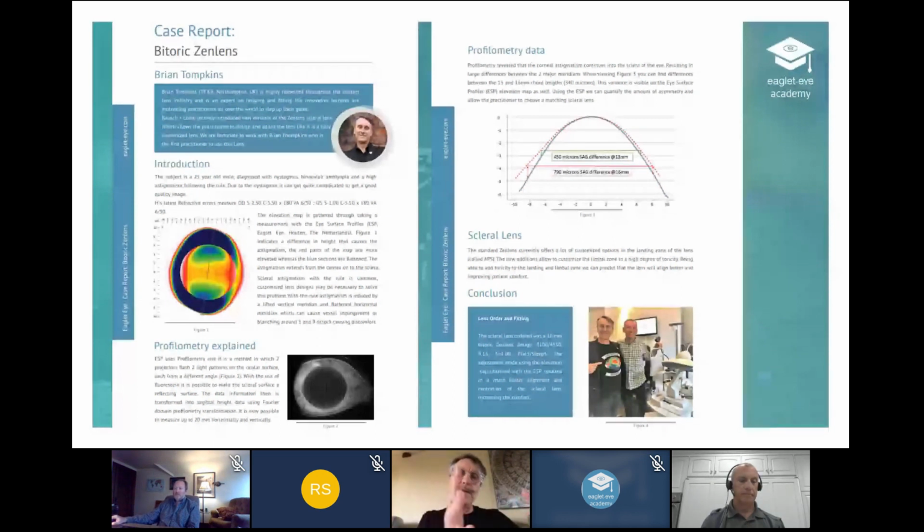So we transposed the information from the ESP over to the lens. And oh man, I wish Sean and I had been born 5 years earlier, because that made life so much more simple. It was just so much easier to say, here is the ESP data, here is the lens that we'd like you to make, because that lens fitted like a dream. And Reinier was smart and clever, wrote it all up into the paper using the data from us. But ultimately, that saved hours and hours of trial, order, trial, order, trial, order. So I kind of applaud the guys for their help.